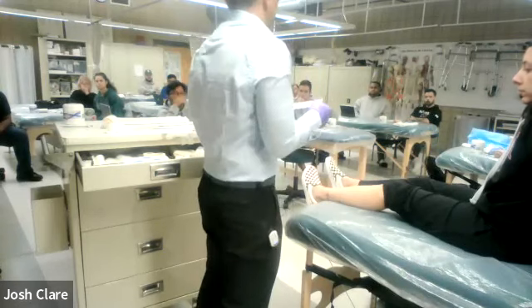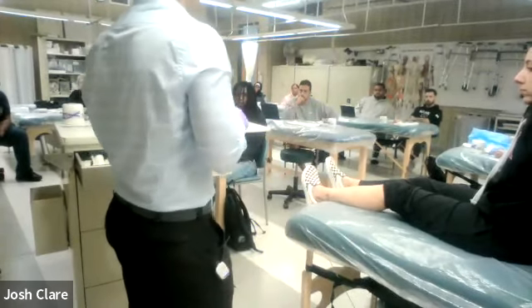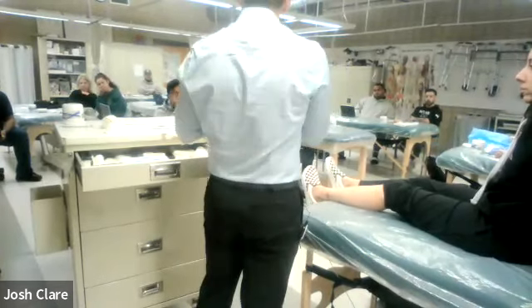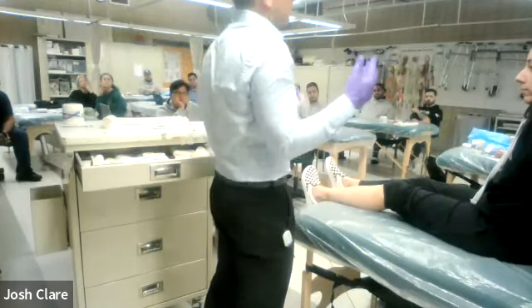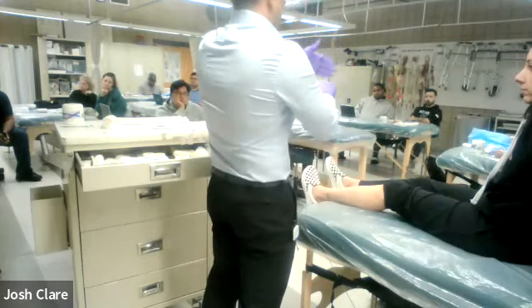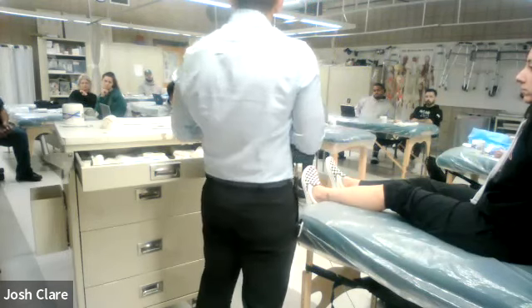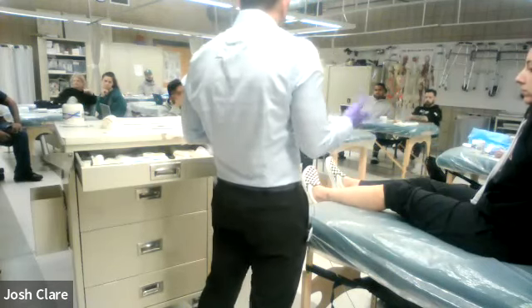This packaging has a ruler on it as well, and there are some sterile or even one-time use devices that we could use. I'll pull up some pictures of some of the other ways we could potentially measure. We need to measure the area: length, width, and depth if possible. For depth, there are sterile tips with rulers on them. If it is a really deep wound — stage three or four — I can put the measuring device into the wound bed itself and measure the depth that way.